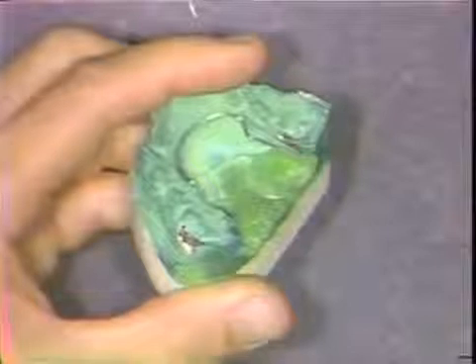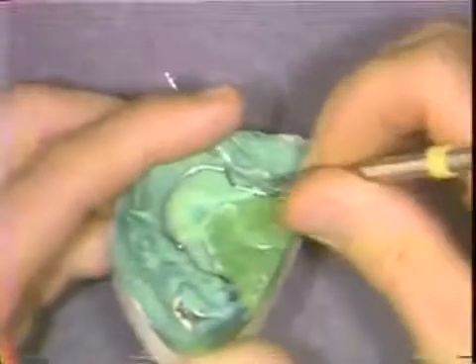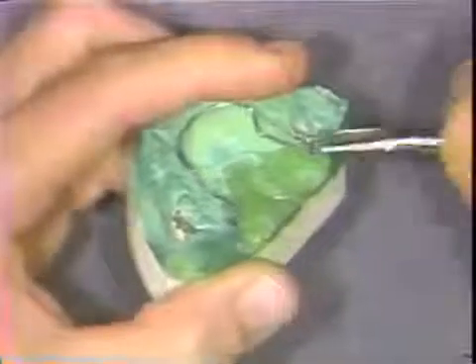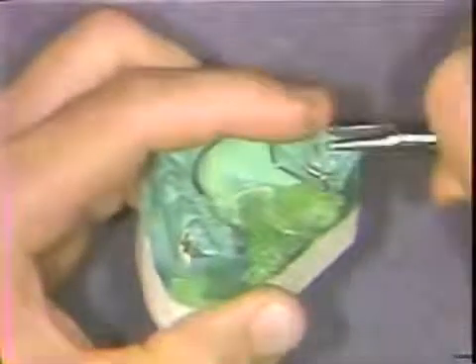One end of the wire is directed beneath the mesial part of the folded back portion, and it is drawn up tightly. A needle holder is used to move the wire into place.